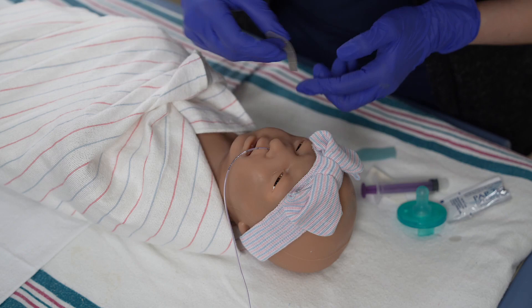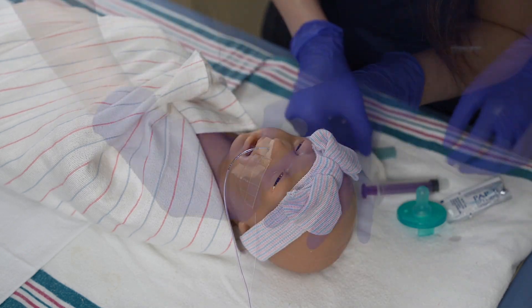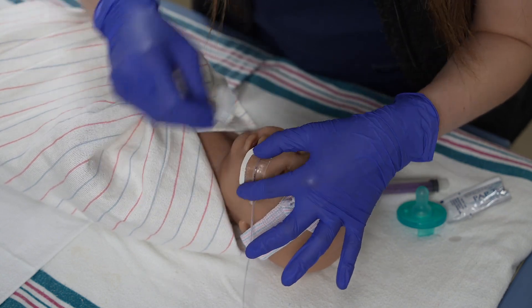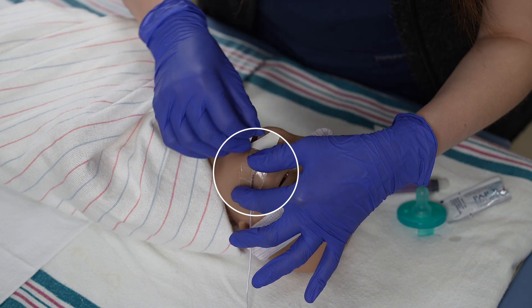To secure the NG tube, apply a hydrocolloid base layer to the infant's cheek, and then a transparent dressing on top. Ensure the centimeter marking is visible.